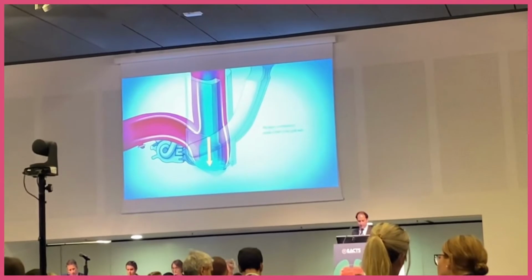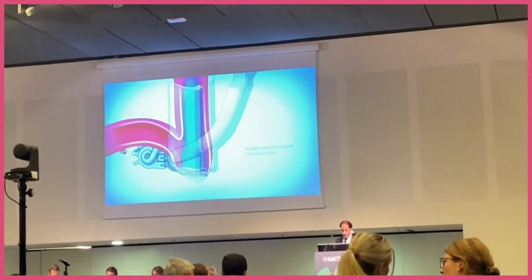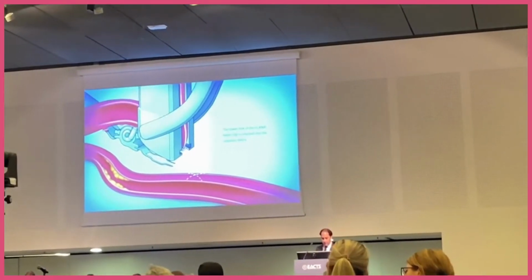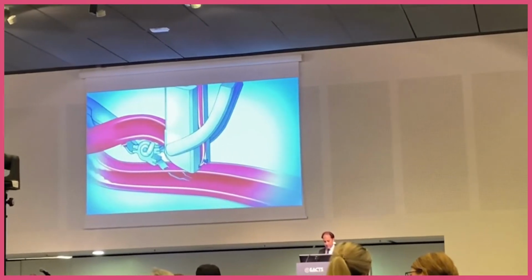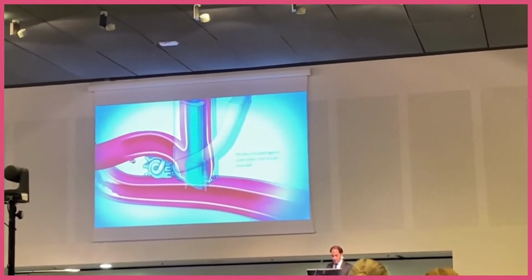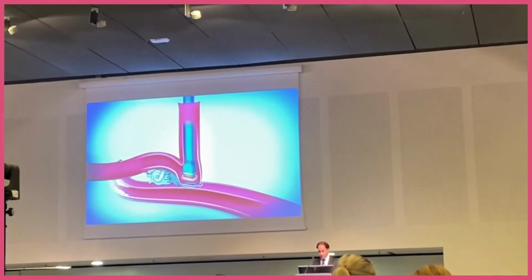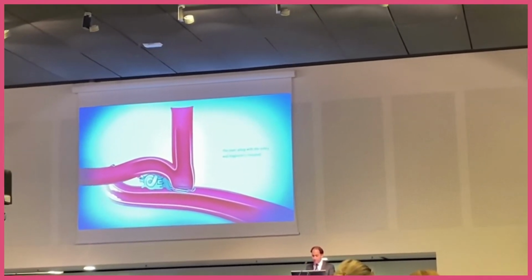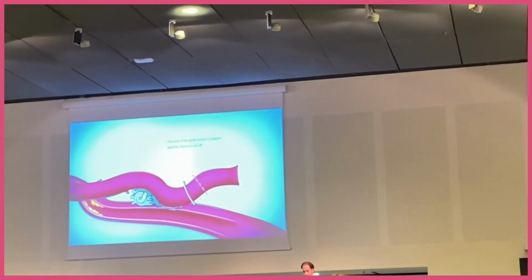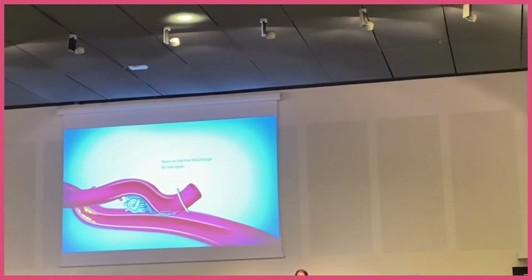The laser is activated and creates an arteriotomy, which is removed, and then the lower fork is opened, goes into the coronary artery, the clip is closed, and then again the arteriotomy is created. The flap is fixed onto the laser catheter by vacuum and is then removed through this end. So a side-to-side anastomosis is created, this end is clipped, and any excess tissue is removed, creating the anastomosis.